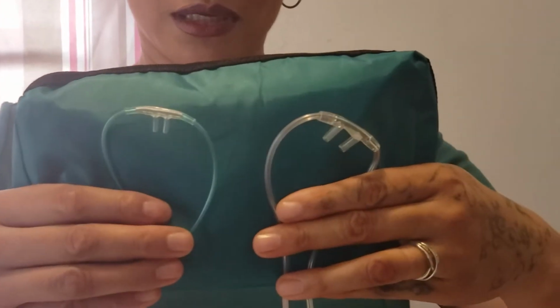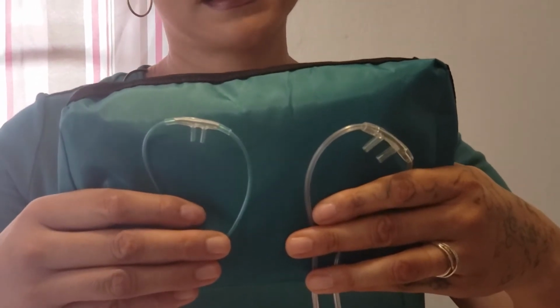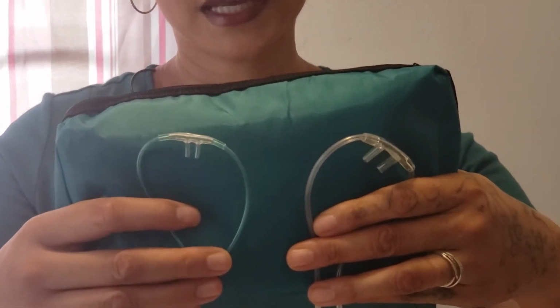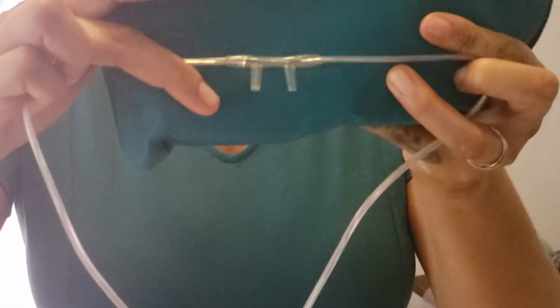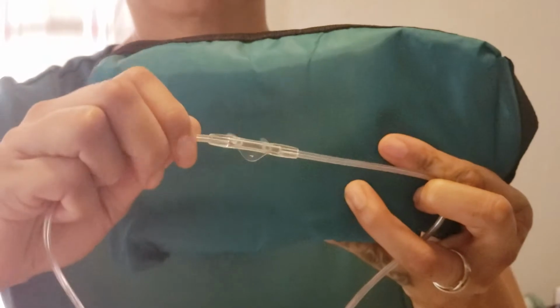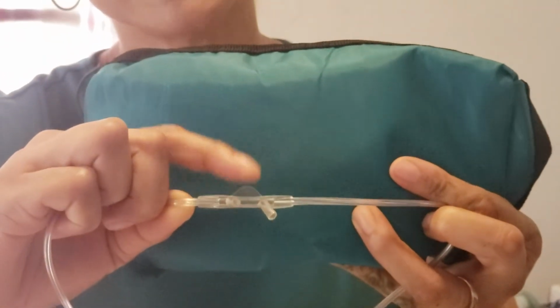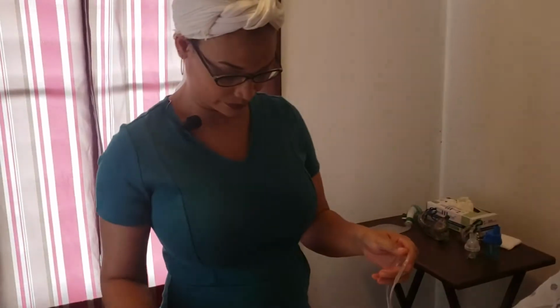Here, you're going to see two different sizes. This one is the pediatric, and this one is an adult. There are several other sizes, but this demonstration is to show that the size of the cannula relates to the size of the nares in which you're going to put it. Another thing of note is you're going to notice that the adult one has a little tab at the top. That tab indicates the top of the cannula.